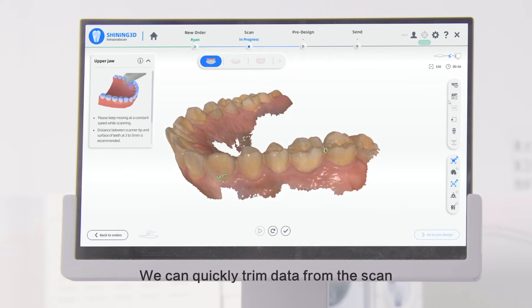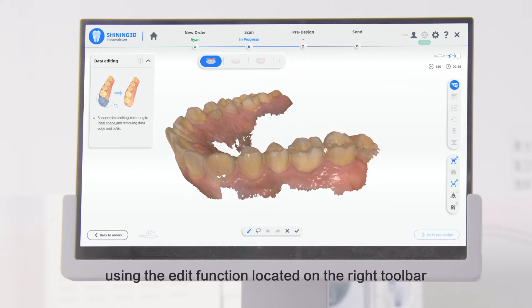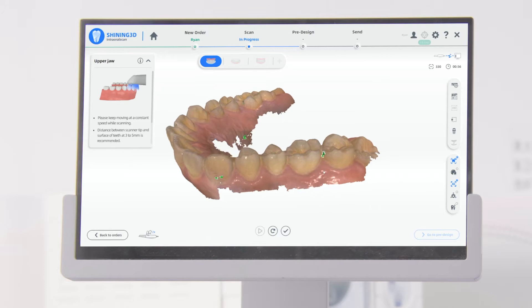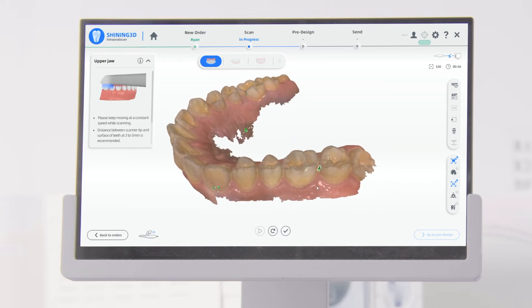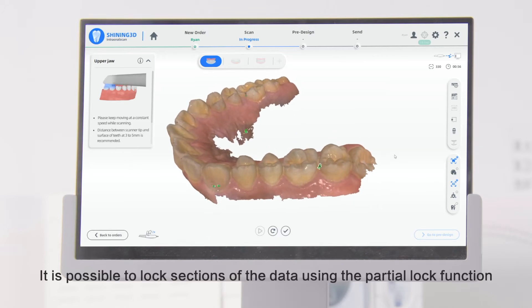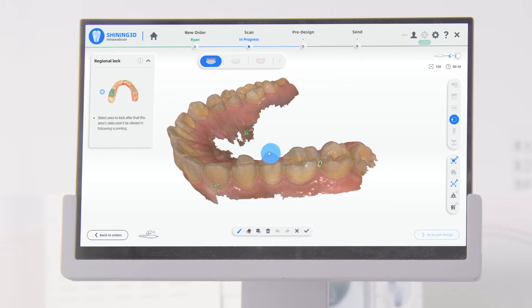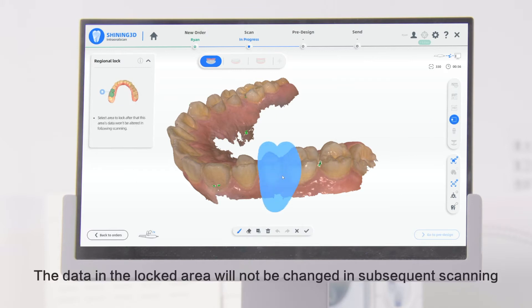We can quickly trim data from the scan using the Edit function located on the right toolbar. It is possible to lock sections of the data using the Partial Lock function. The data in the locked area will not be changed in subsequent scanning.